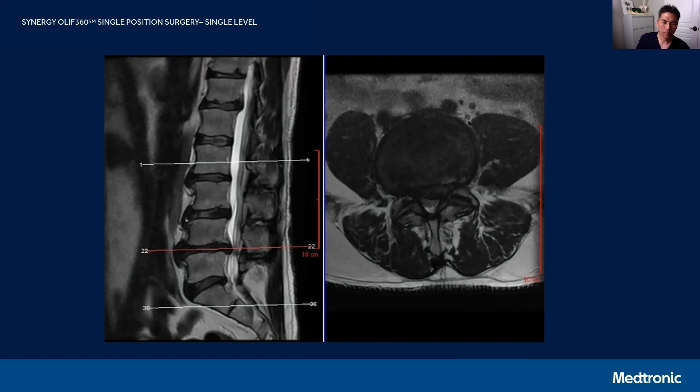Typically in older patients — older female patients especially — you'll see that the psoas is significantly smaller, it's easier to retract, and it's more pliable. But in men, or younger men especially, the psoas tends to be quite large in size.